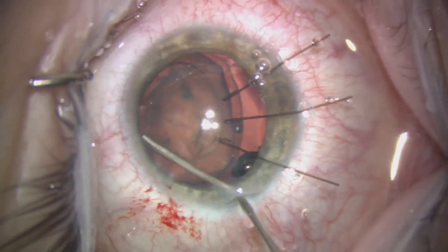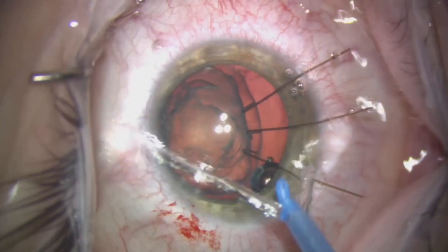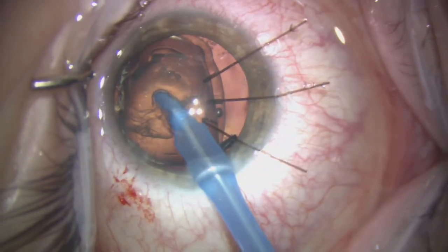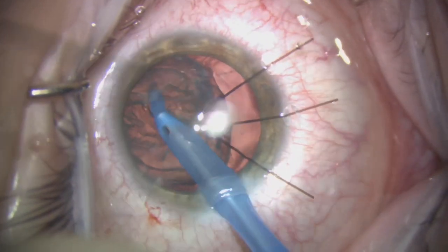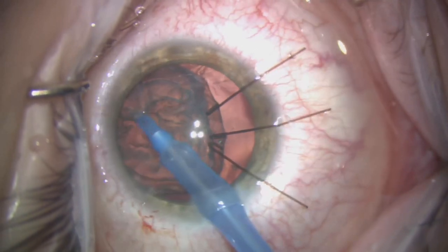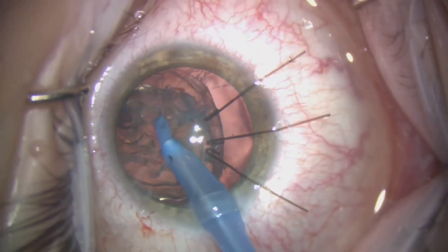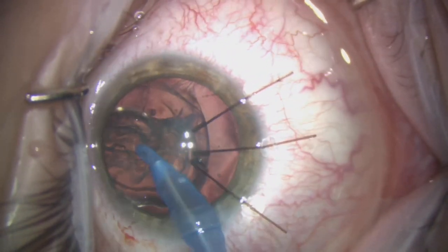This is a clear crystalline lens so we're going to use an I/A handpiece to aspirate it out — there's no need for a phaco probe here. The lens is very, very soft and easily removed using an I/A handpiece, as can be seen here.